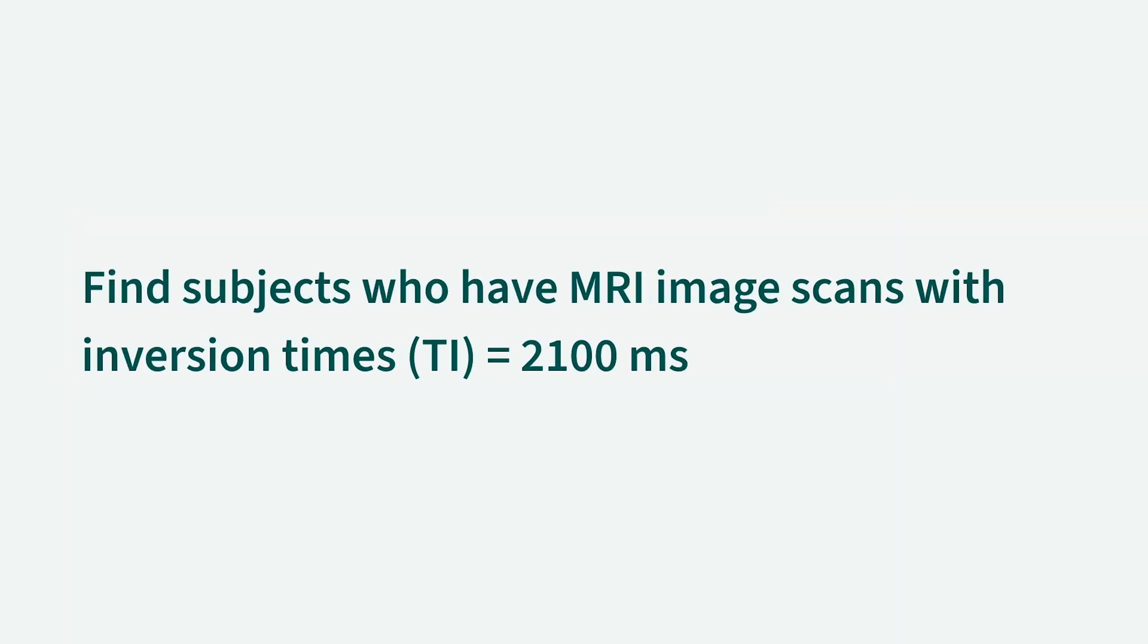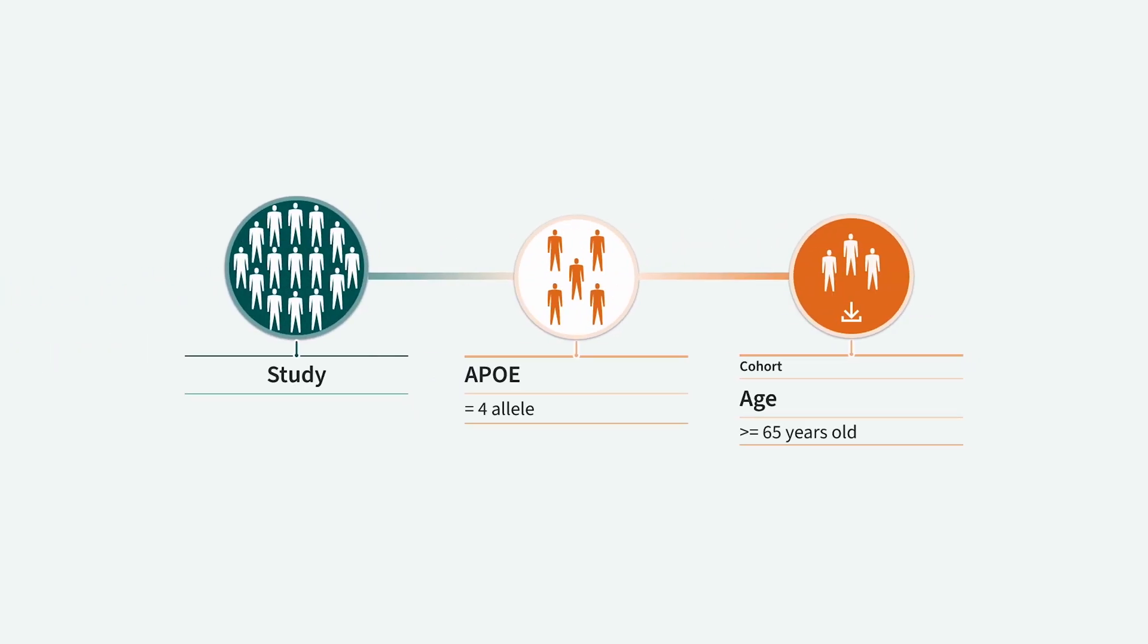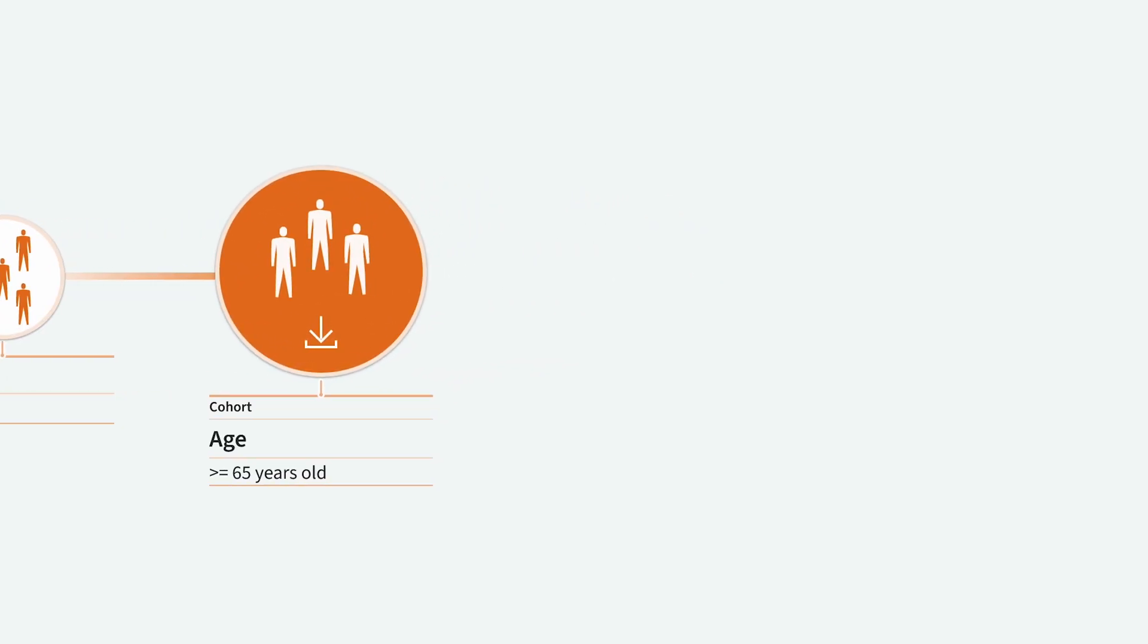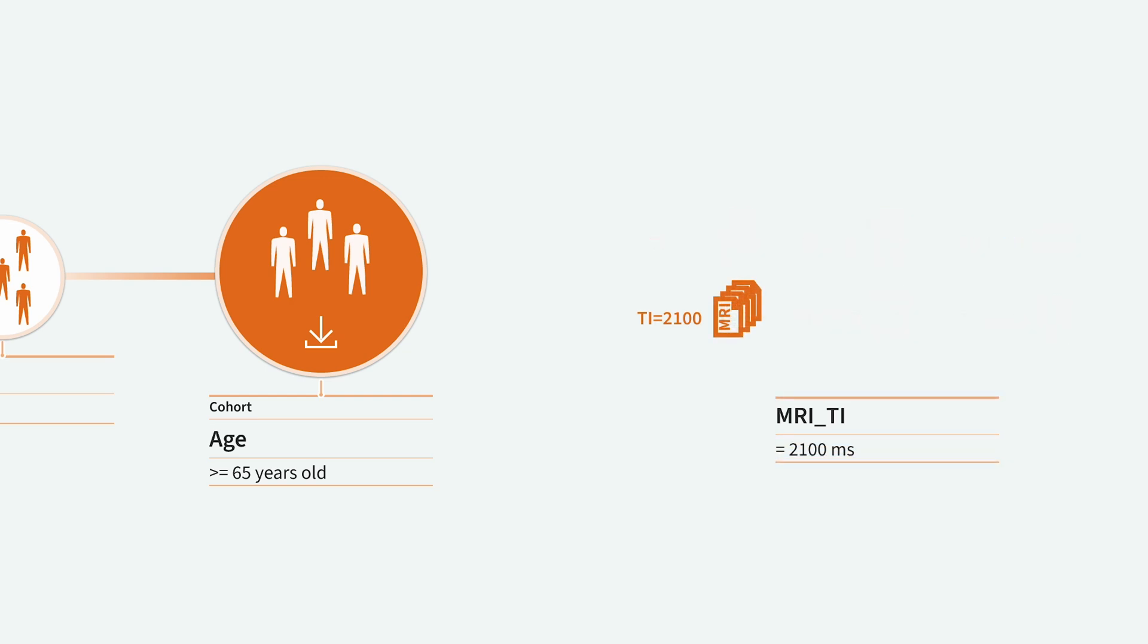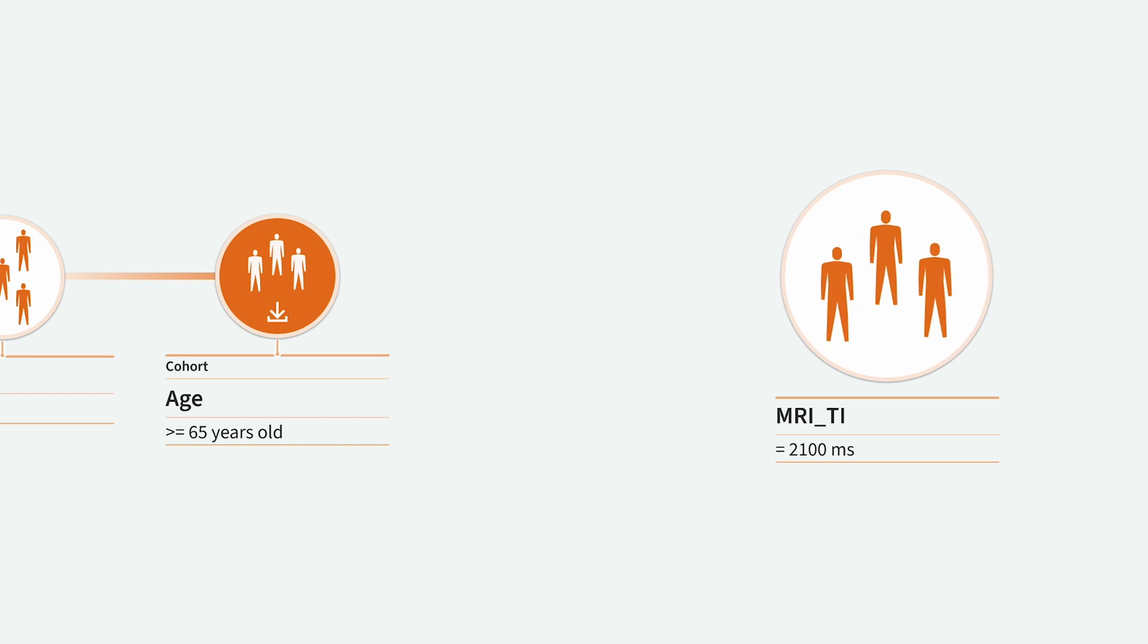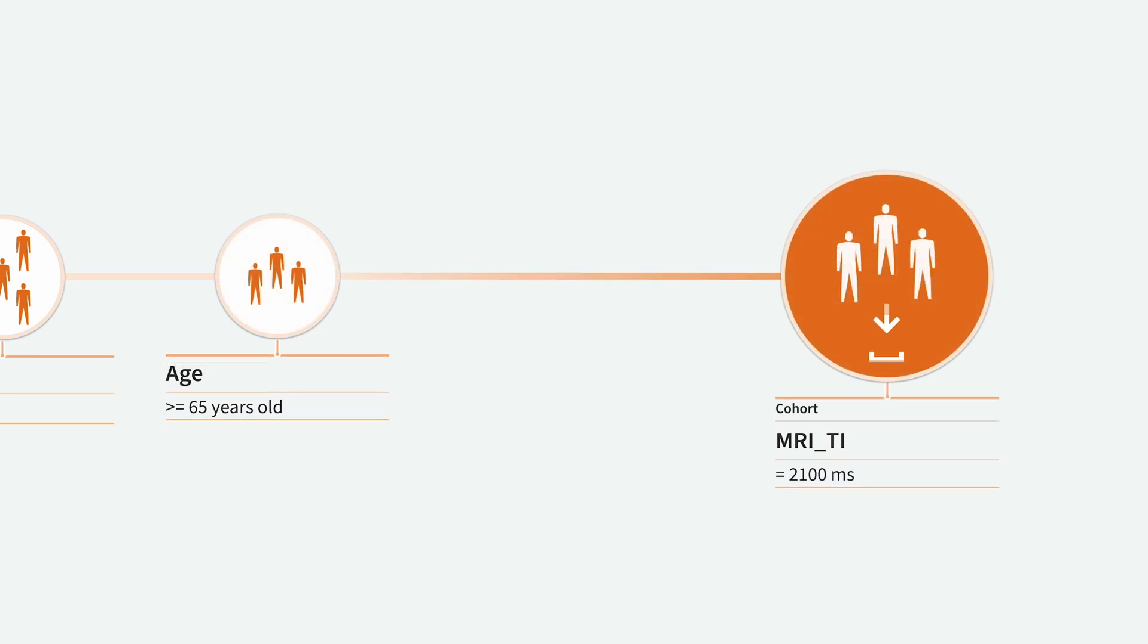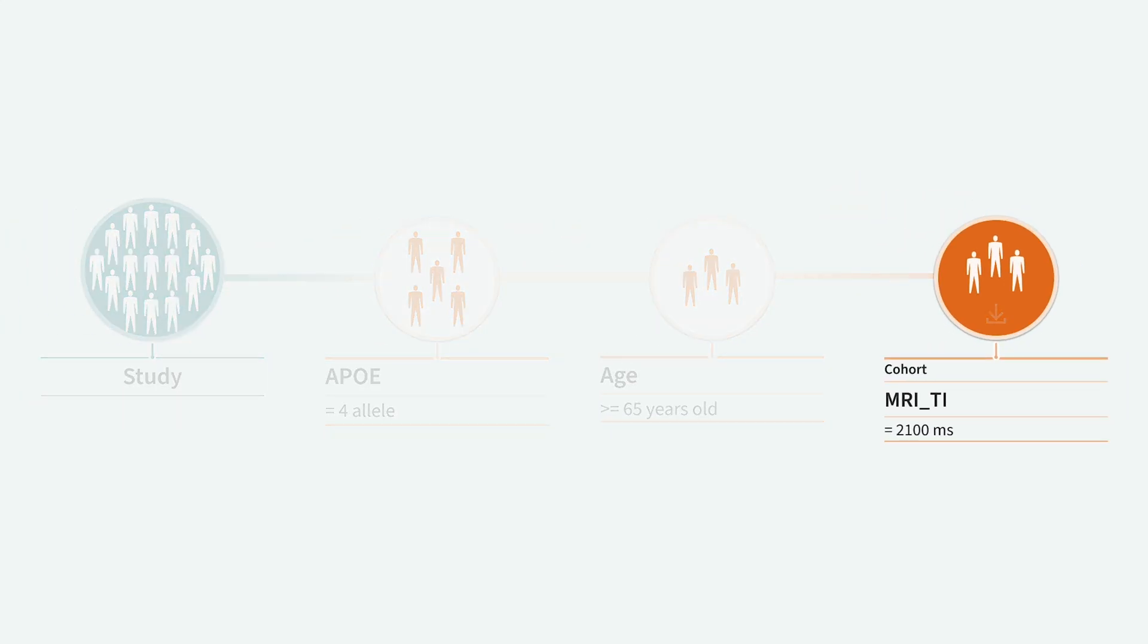In this example, we will search for subjects with MRI scans that have an inversion time of 2100 milliseconds. We start with a cohort of APOE for subjects who are 65 years old or older. As there may be different inversion times for these scans, our goal is to limit the cohort to subjects who have scans with inversion times equal to 2100 milliseconds by adding another filter at the end of the filter chain.